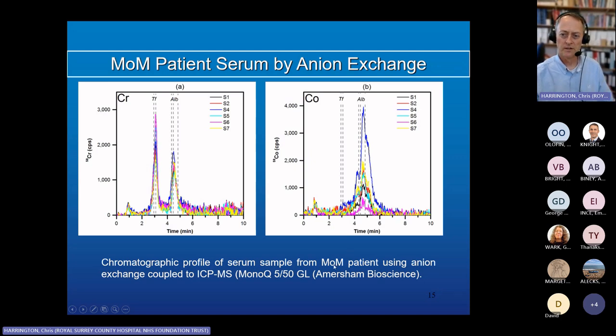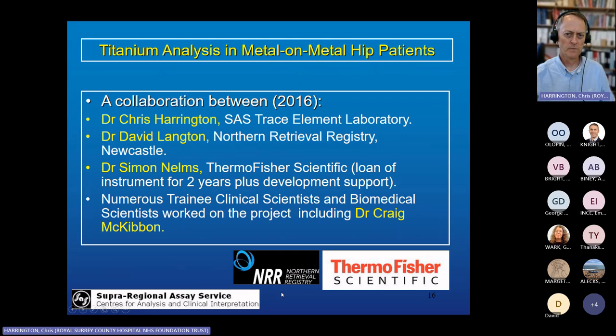But it did answer this question we had, and it turned out when we looked in the hip fluids there were very high levels of albumin, and that was later used by the people up in Newcastle to develop some further assays that I'll go on to tell you about in a moment.